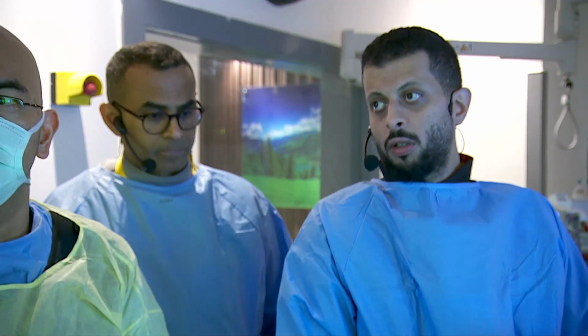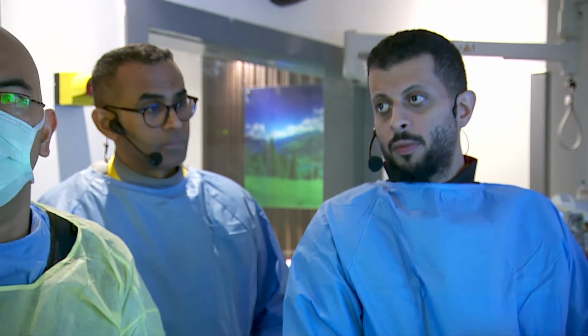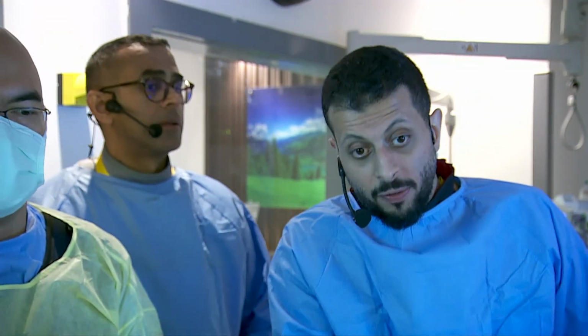And what's the expected time? Sorry, go ahead, Prof. Ibrahim. No, please. What is the size of these stents, the diameters? The size of the diameter of the stent.